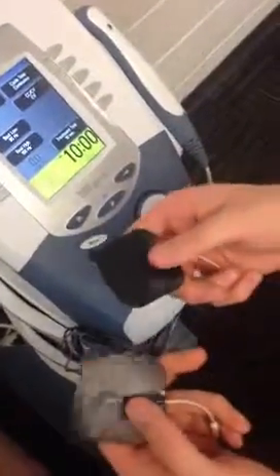You want to check the adhesiveness of the pads, make sure that they're sticky enough so that they stick to the area. A big concern when doing male patients is that they have hair on their legs or any other area of their body, so it might not stick as well. So we want to make sure that these are adhesive, not necessarily new pads, but we want to make sure that they'll stick to the treatment area.